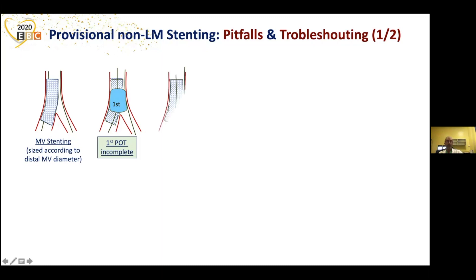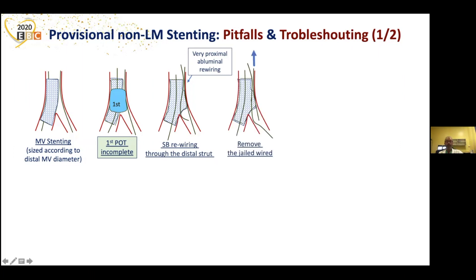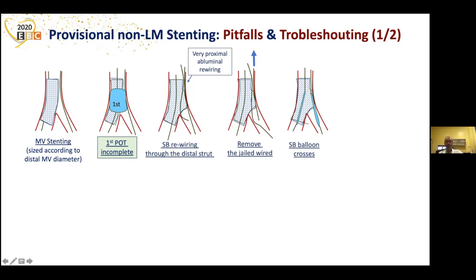When you have this incomplete POT, what happens is that you have a proximal stent malapposition. The next step is to rewire the side branch through the distal strut. You can take a third wire and cross to the distal strut. But the wire, before crossing there, went to a very proximal abluminal position — proximal rewiring was done. In the next step, you remove the jailed wire and start doing your kissing balloon. The balloon in the side branch is able, because it's a new balloon, to go into the side branch in the correct position.